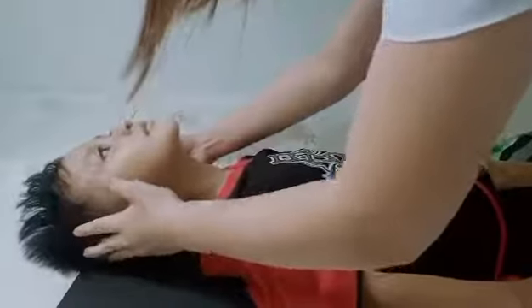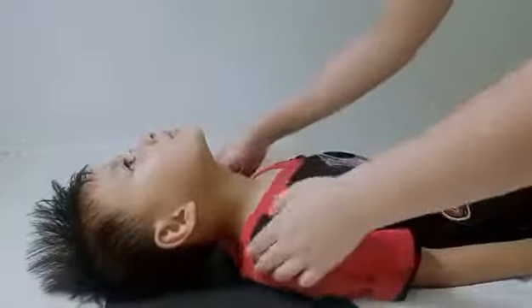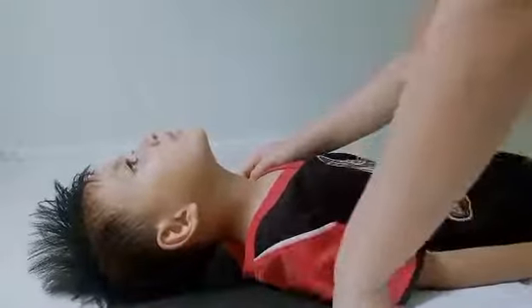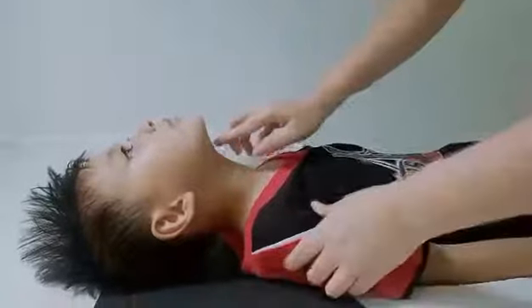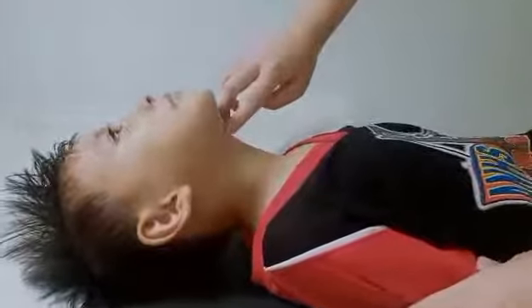Adjust the patient's head to the mid-sagittal plane, so that the mid-sagittal plane is perpendicular to the plane of the grid. Central ray is perpendicular to the midpoint of the IR. It enters the neck on the mid-sagittal plane, just distal to the tip of the chin. So, here the central ray enters here.